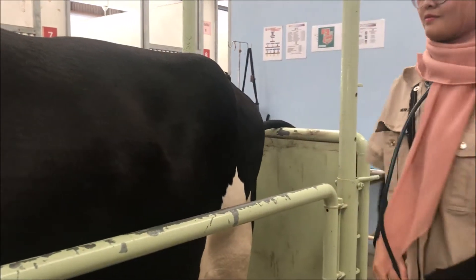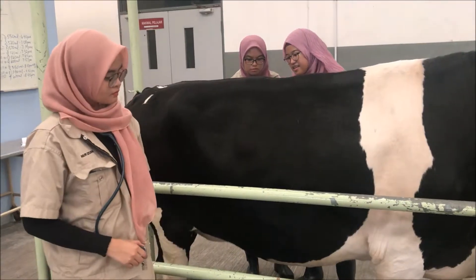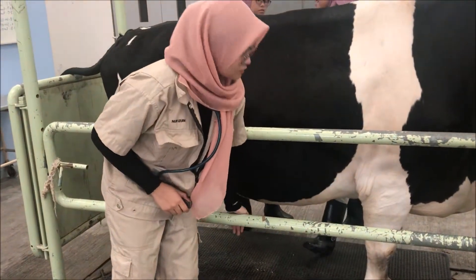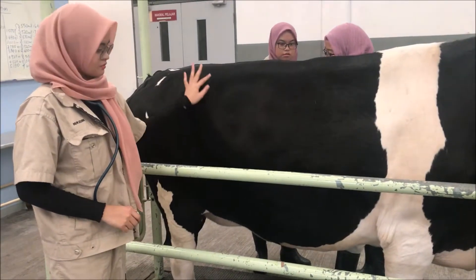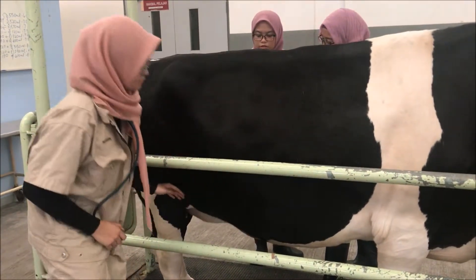Next, we move to the right side of the cattle. The same technique needs to be done at the right side. As usual, we need to locate the landmark region before we start. The landmark region is from the point of elbow to the wing of ilium, including the lower abdomen region.